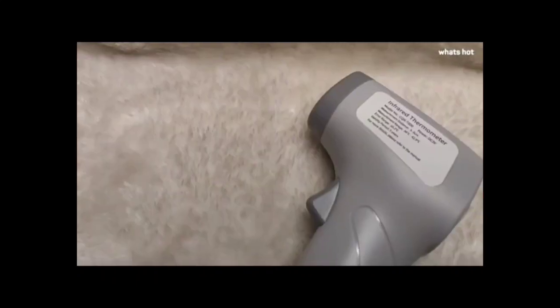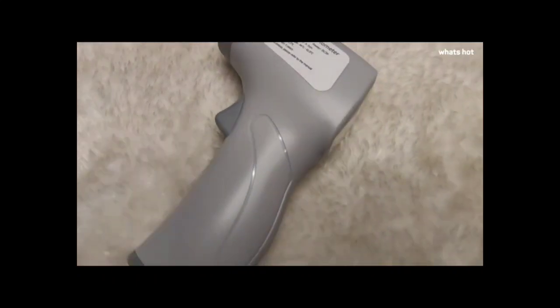Hi everyone, my name is Abhay and today I'll be reviewing the Vandley Infrared Thermometer. So let's get started.